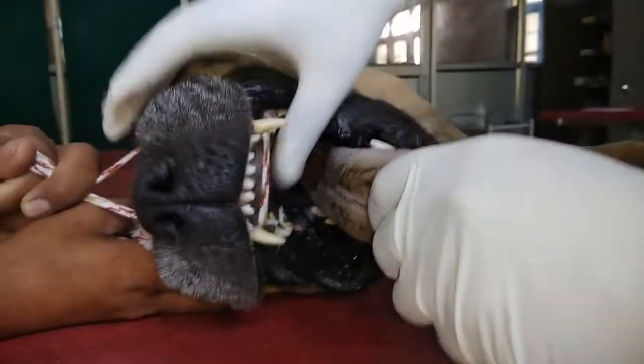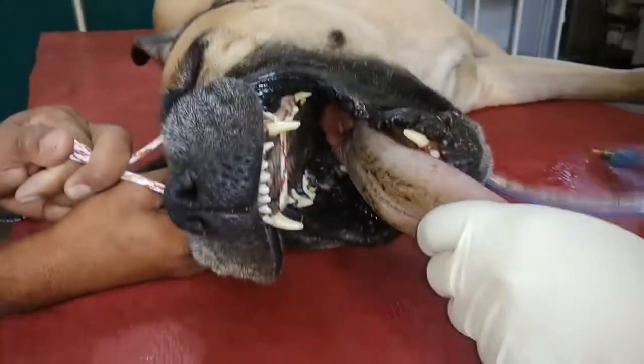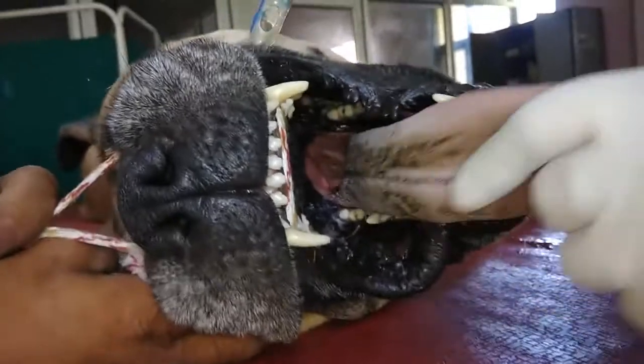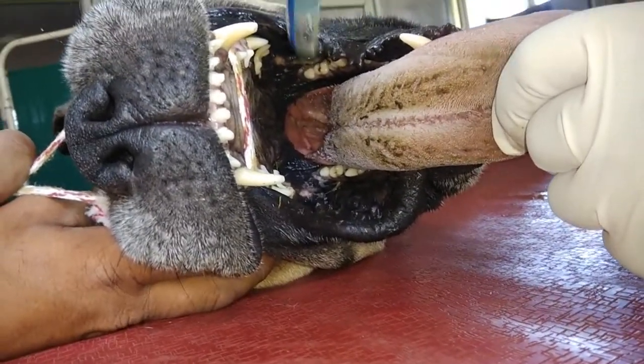For the intubation, we keep the neck straight. One assistant pulls the upper jaw, then we pull the tongue, and then we pass the endotracheal tube.